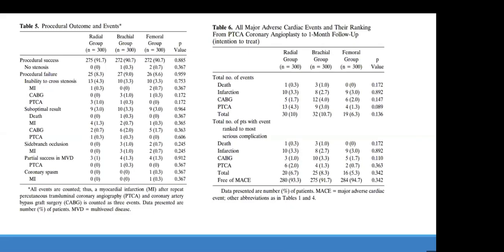Why? Because the femoral access is your safeguard. You can't insert a balloon pump in the radial. You can't insert an impeller in the radial. You can't do TAVI in the radial. So you have to learn femoral.